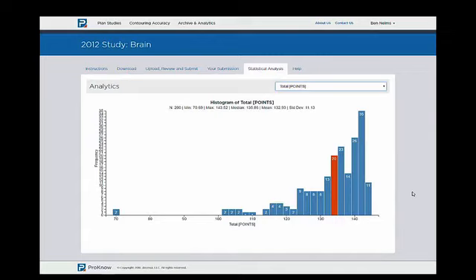Now, while the study is running, we don't want to show you these results versus the population because that might bias your results one way or another. We just want to let you know this exciting tool will be at your disposal when the plan study is closed, for you to come back in and check on at any given time.